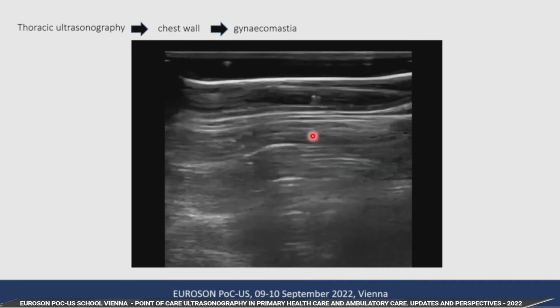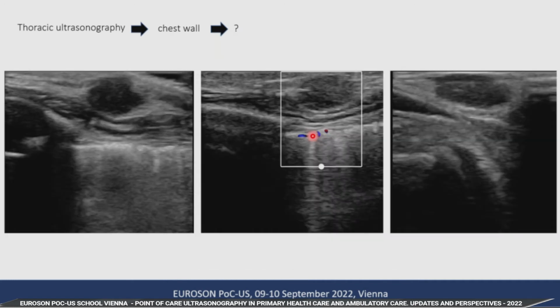We had a patient who is an adult patient and who came to us and he said that, well, I have few lumps on my chest wall, doctor. So the skin is okay. You touch the lumps, they are quite hard. You put a probe on it, and the first question is, is it similar to a lipoma?